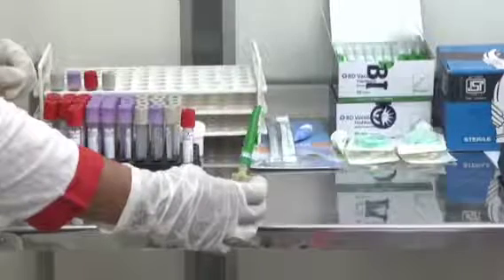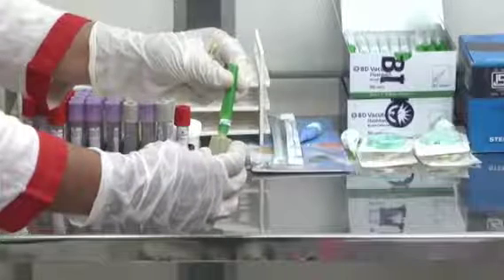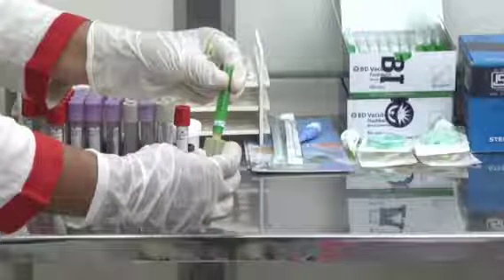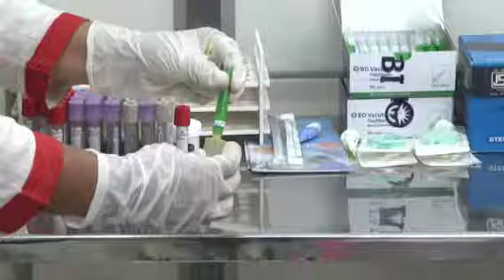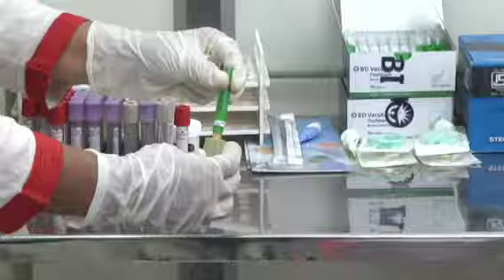Lift the needle vertically, and once the tip is covered, use the other hand to fix the cap into place. Clean the surface with disinfectant afterwards to avoid leaving any drop of blood.